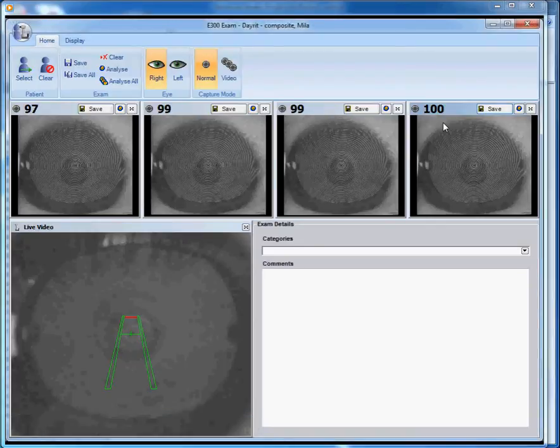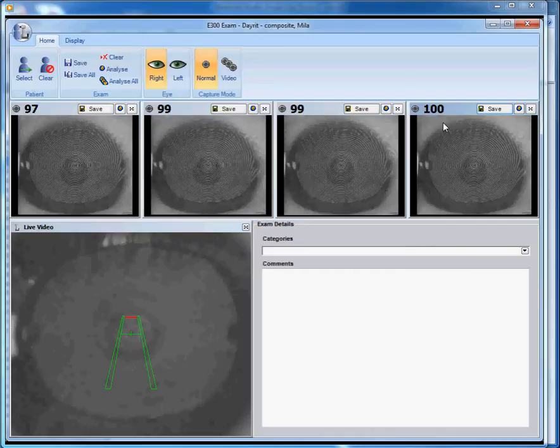However, it can be tricky to get in quick enough before the tear film breaks up. By pulling the lid back, we're hindering normal blink rate and normal tear flow across the corneal surface. So that last capture will be the trickiest of the bunch, but it is possible to do on most eyes.